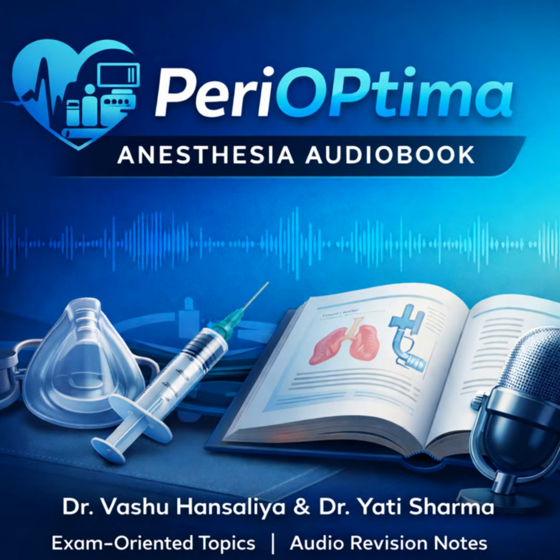Laryngoscopic views and grading. This system, from Cormack-Lehane back in 1984, is the absolute cornerstone of how we document and communicate airway difficulty. You must know it. Let's start with the original 4 grades. Okay, grade 1 is a perfect view.